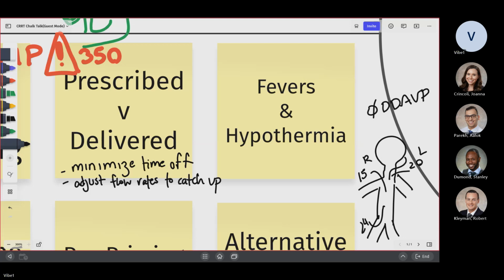Yeah, Joanna, you had a question or something? Not so much a question, just somewhat of a comment, something that I've heard while I've been here at Atlantic Care. For the preference of sites for a hemodialysis catheter, usually they avoid subclavian, and the thought process, at least here, is that they try to preserve that for patients who may end up needing long-term access. So that would be your last option for a dialysis catheter. Do you feel the same way?